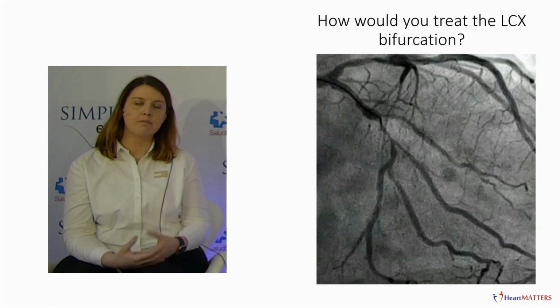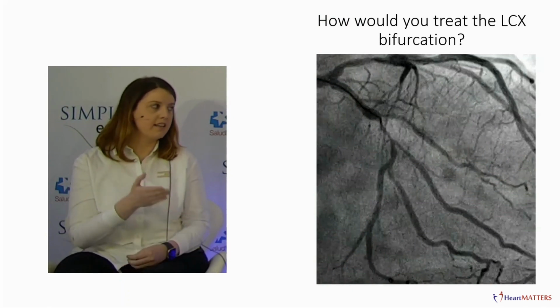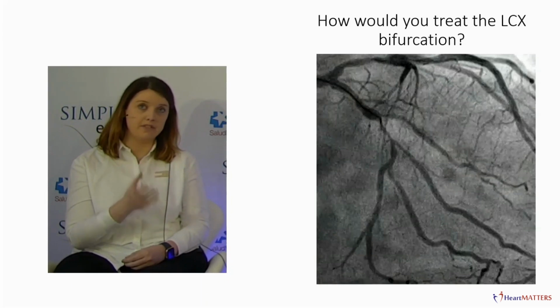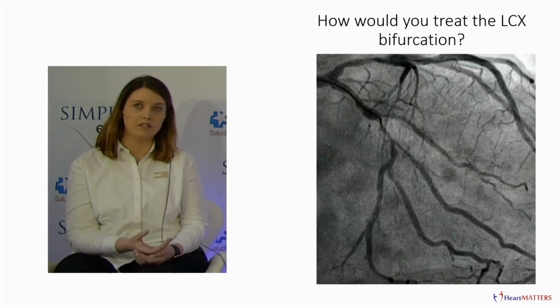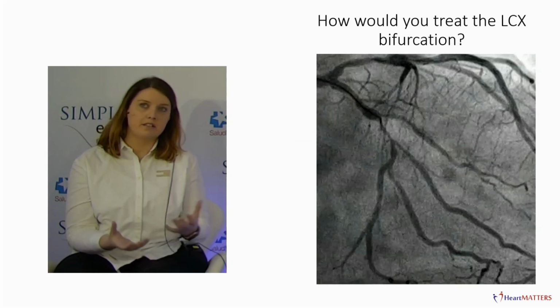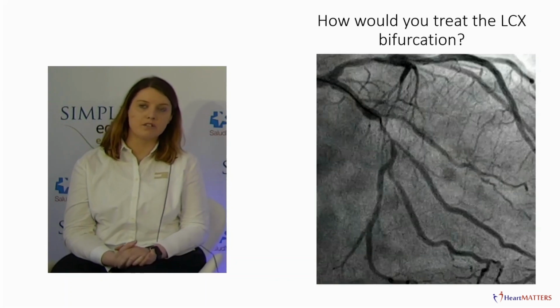So if I understand what you're suggesting, then Prida, it will be that you will try to get as much information as possible to support, if possible, the use of a provisional stenting. Is that correct? Yes. Enrique, what would be your attitude?